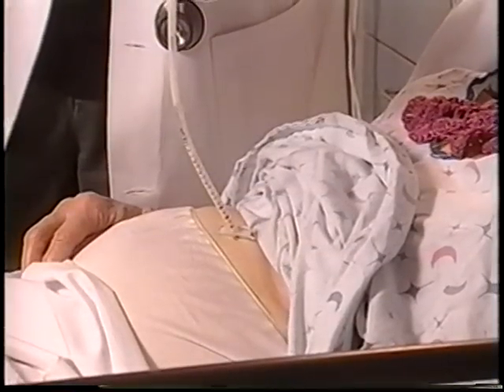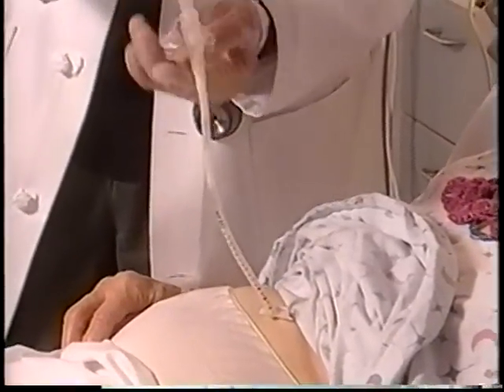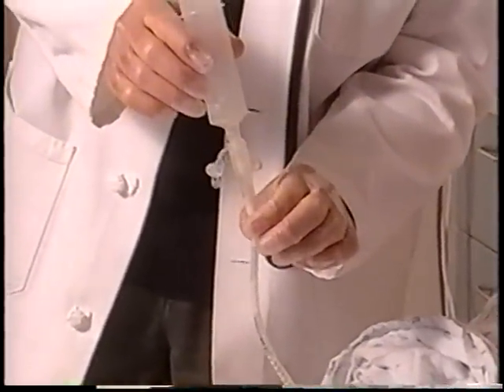Whether a patient is using a syringe or pump for feeding, the equipment must be properly cared for. After they return home, we ask them to rinse the feeding equipment after every feeding, and if they need to, they can wash it with warm, soapy water, but be sure that they rinse it thoroughly and dry it and keep it in a safe, dry place.